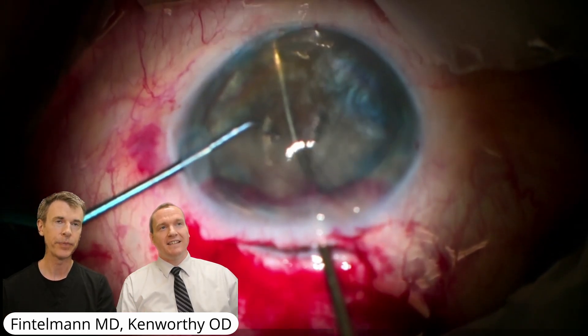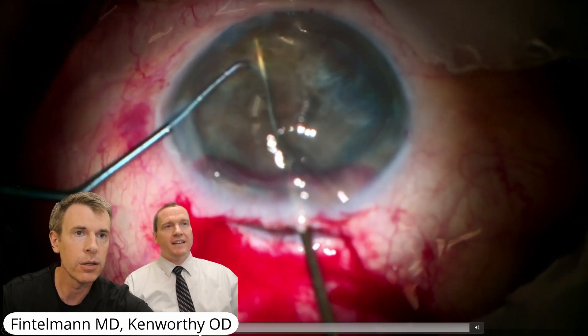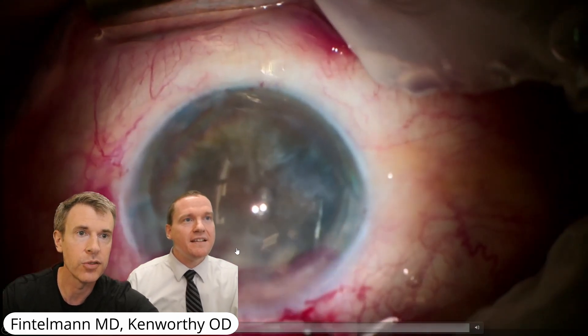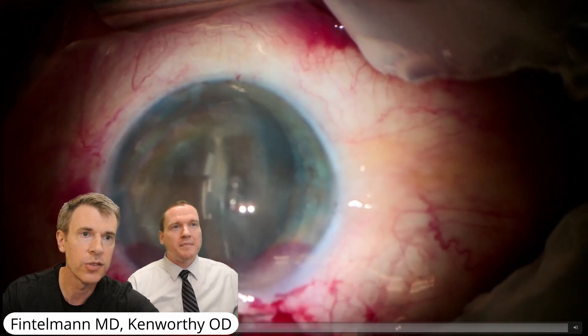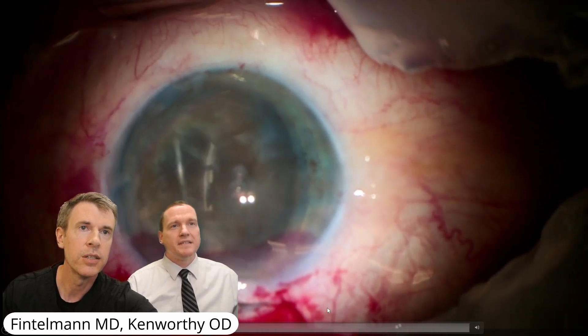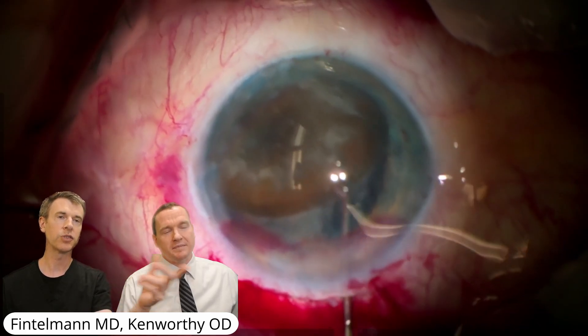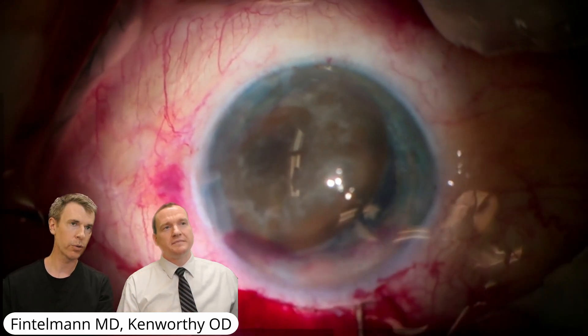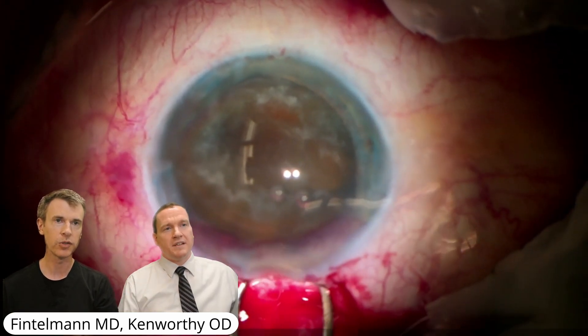And the zonular laxity — this is actually the whole lens being pushed into the anterior chamber. The capsule is still part of it. There's a six millimeter incision on this side. So it's going to be called manual small incision cataract surgery. It's still large, but smaller than the previous extra-caps where we split up the cornea almost 180 degrees.